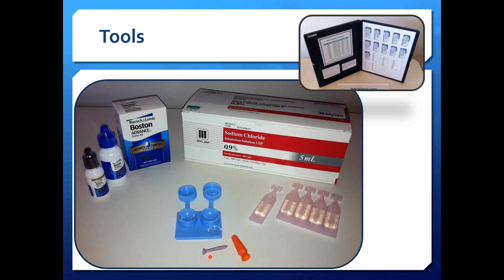But you do want the smaller DMV. We use the 45 degree so that the patient can see the DMV coming toward their eye and they just place it on the inferior portion of the lens. The 45 degree is a little more beneficial for removal that way.